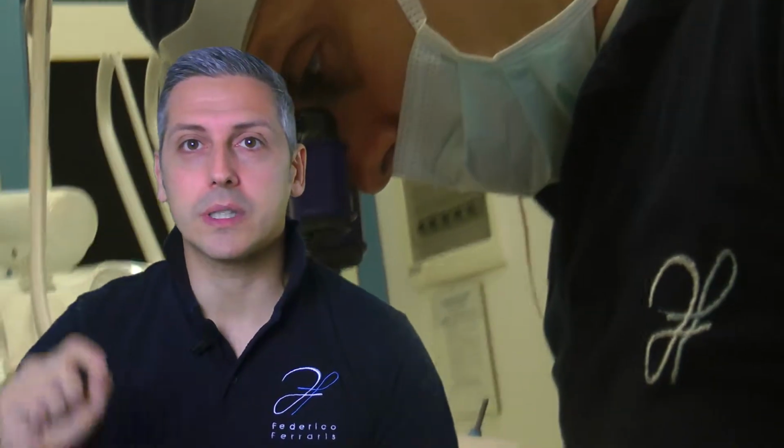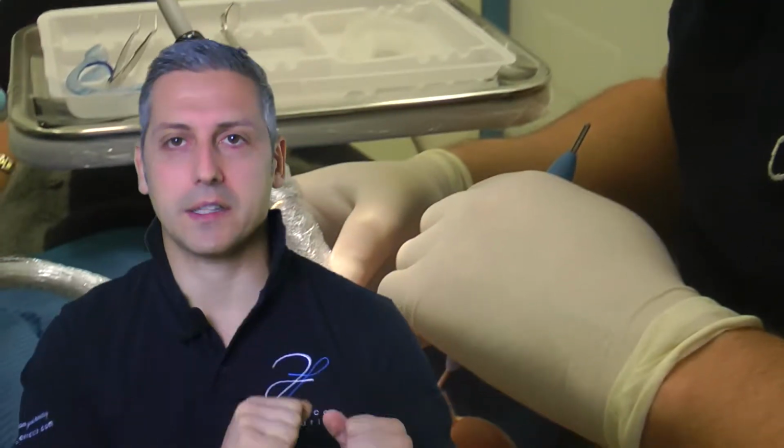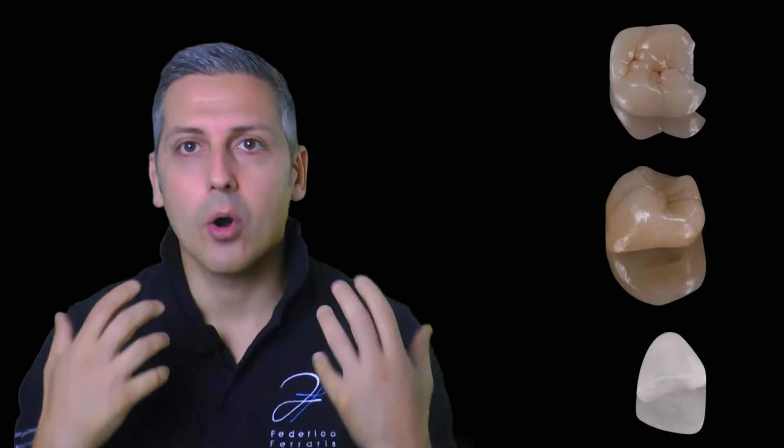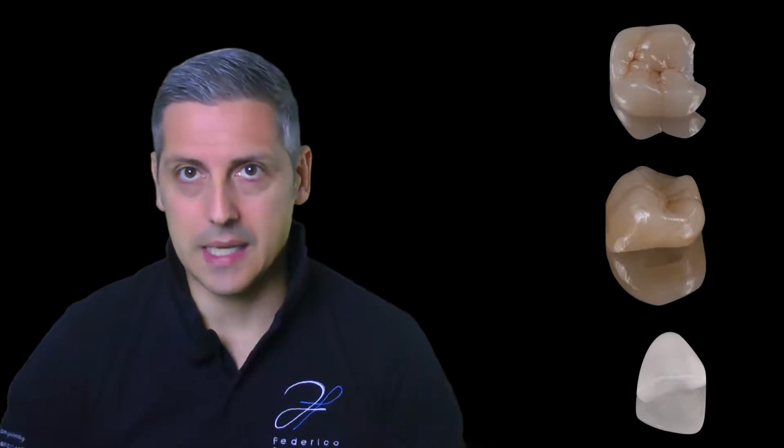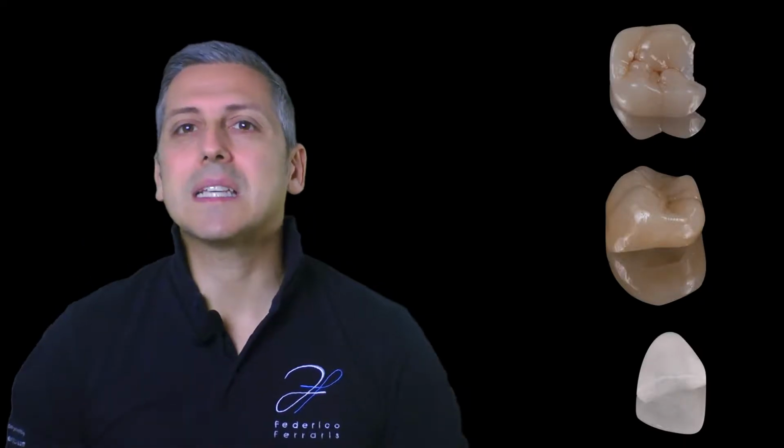Today I want to share with you some concepts about the protocols in preparation of indirect restoration. This restoration could be onlays, overlays, but could be even crowns or laminates. The concept is about the occlusal reduction and the grooves that we can create when we decide the occlusal reduction.